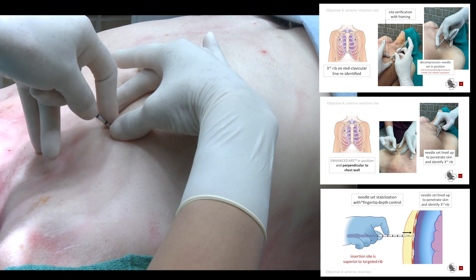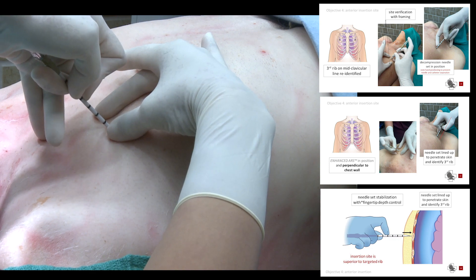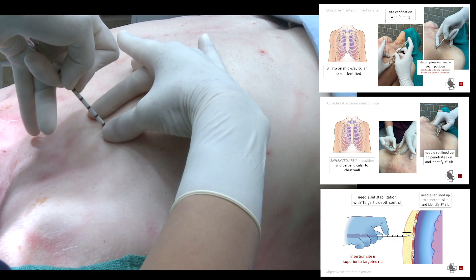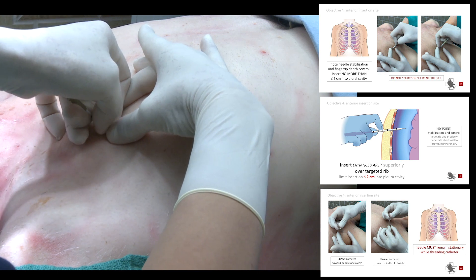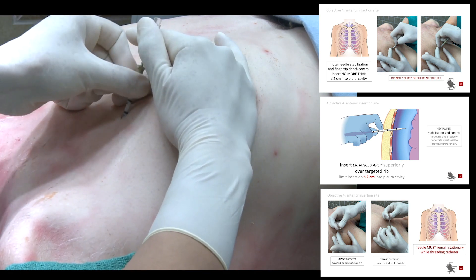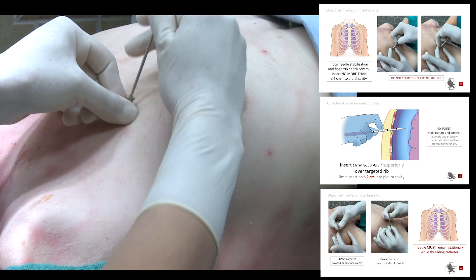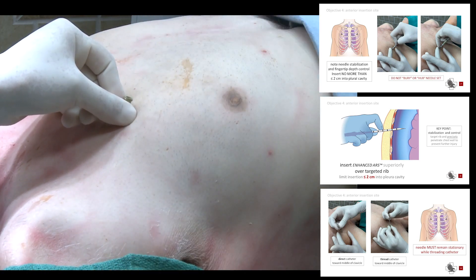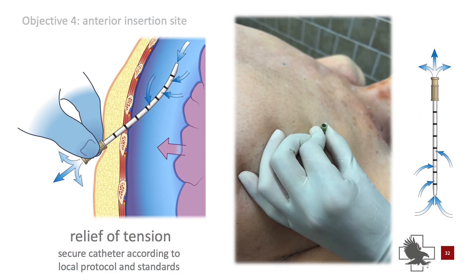Identify the target rib with the needle tip. Insert the catheter with control. Thread the catheter toward the clavicle, keeping the needle stationary. Tension should relieve at this point. Hold the catheter in position and secure the catheter hub according to protocol.